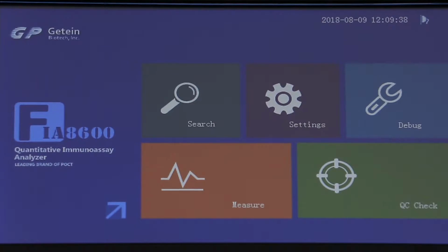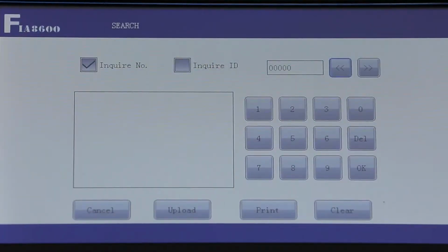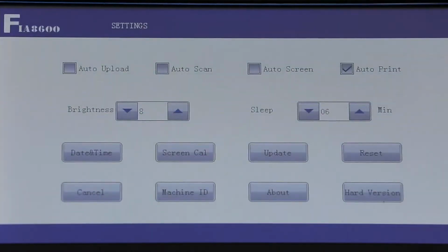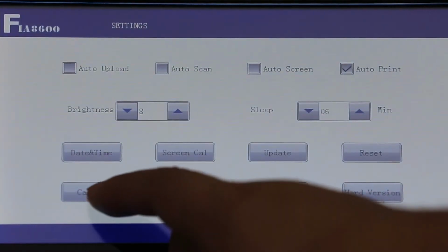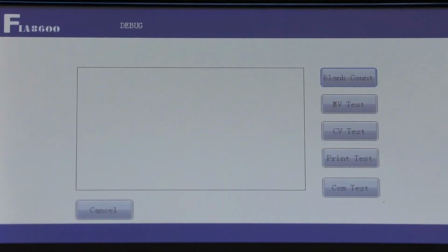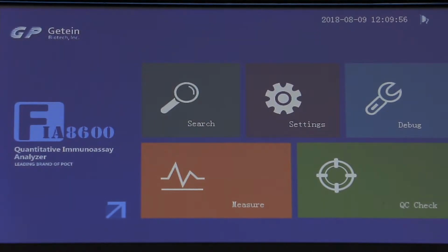Then let's look at the touchscreen. The icons on the color touchscreen will lead you to navigate through the menu. Click Search to check saved data by typing in a test number or an ID number. The searched results can be printed out manually. Click Settings to set common functions of the instrument. Click Debug to adjust internal parameters of the instrument and to test common functions.